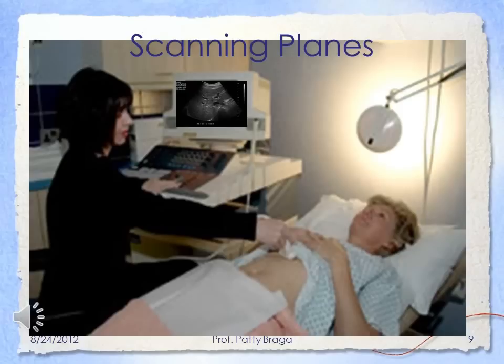but what I want you to look at is the foot of her transducer is on the anterior part of the patient's body. Top of the screen is anterior. The bottom of the screen is posterior. To the left of the screen is the patient's right side. To the right of the screen is towards the patient's left side.